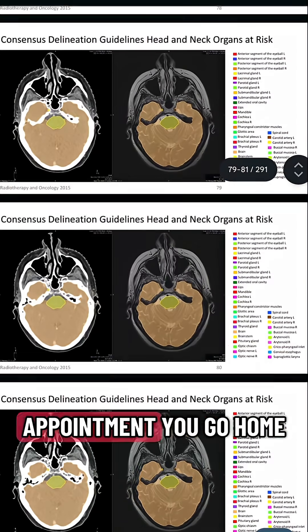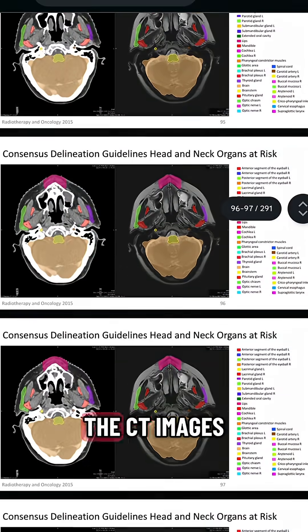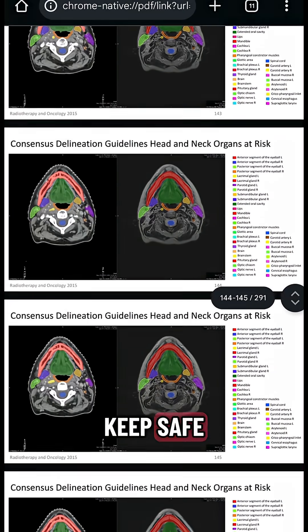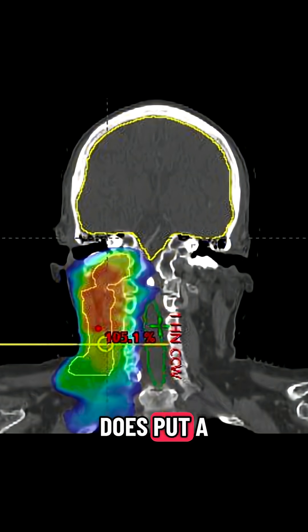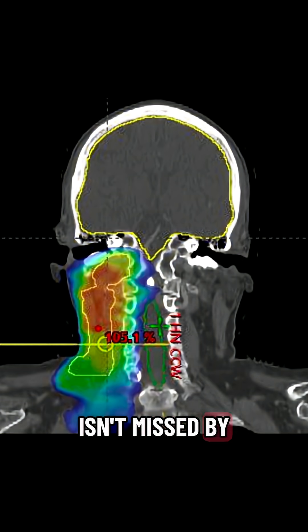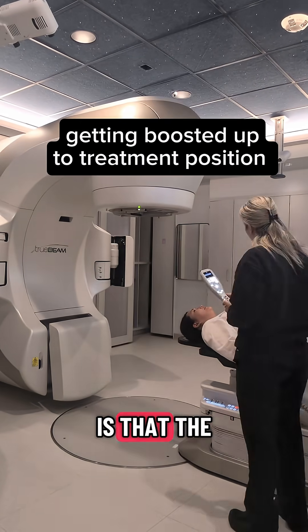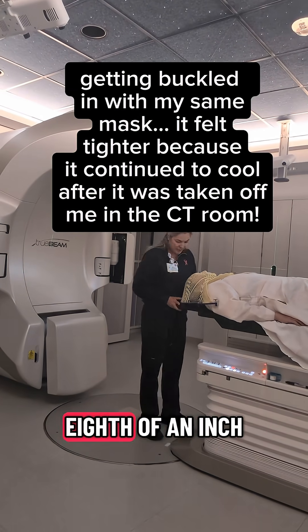After this CT appointment, you go home and your radiation oncologist will spend hours drawing on the CT images to define important internal organs that we want to keep safe, as well as the cancer itself and the lymph node areas at risk. Your radiation oncologist does put a tiny safety margin on the target volumes to make sure that your tumor isn't missed by the radiation. The most important thing I want to point out is that the mask allows that margin to be only a few millimeters, or about an eighth of an inch.